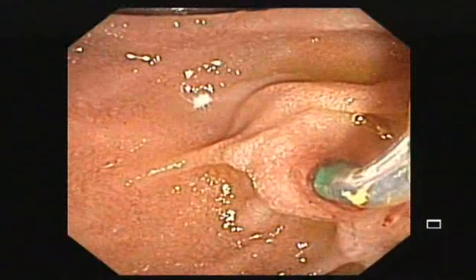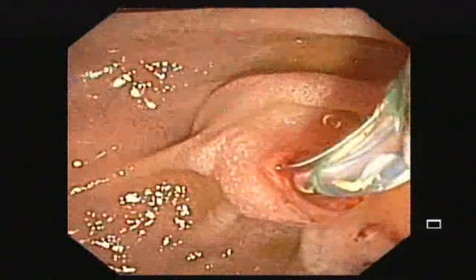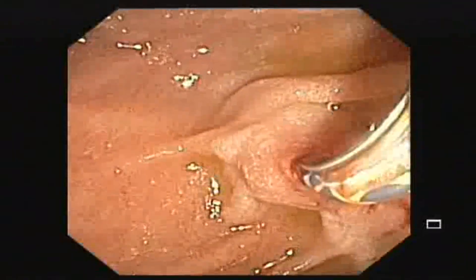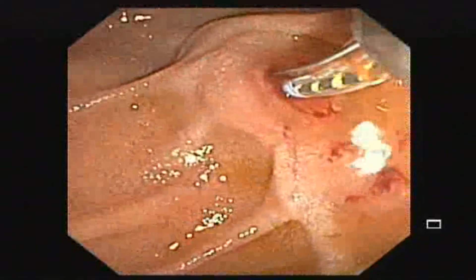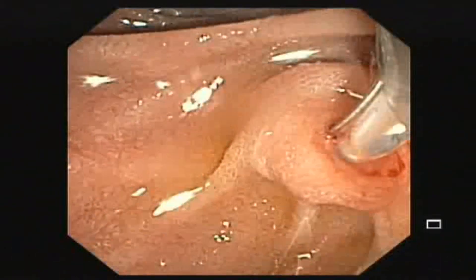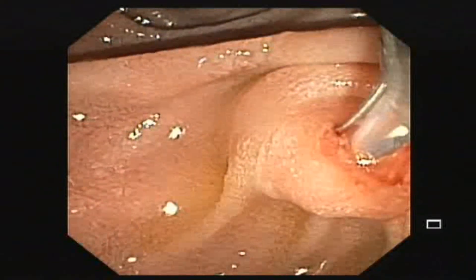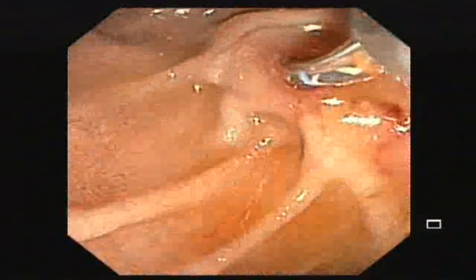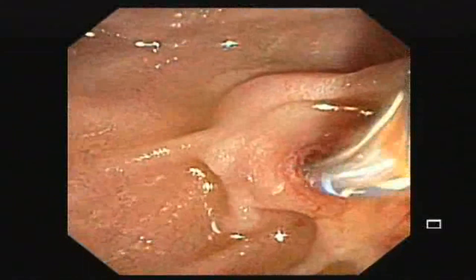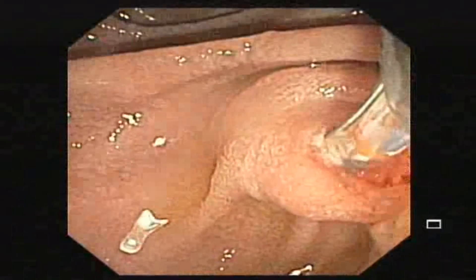After cannulation, the next step is to cut down the ampullary orifice. This helps in sweeping with the extractor balloon. Because the opening is very small, we are going to extend the ampullary orifice. The ampullary orifice is now cut.